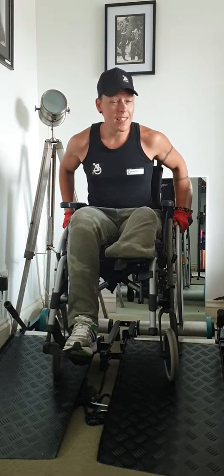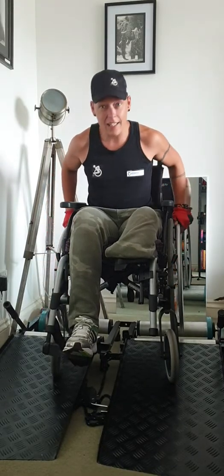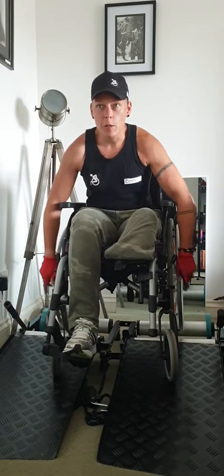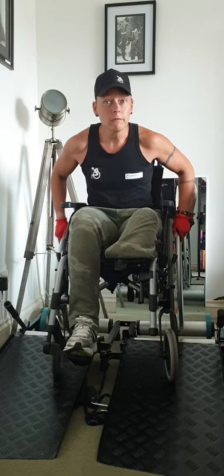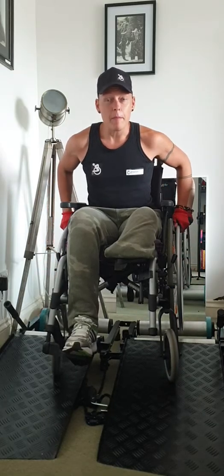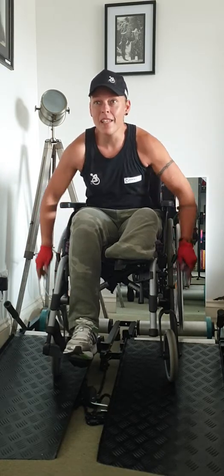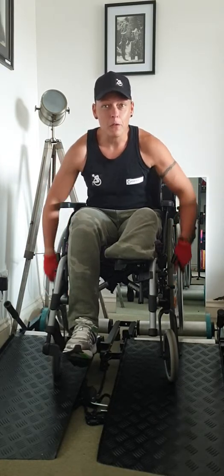I can also change the setting on this — I can make it harder and I can make it easier, which is good. I've got it at a pretty even keel at the moment, which basically feels like I'm doing a constant hill. It helps build up a bit of power and strength in my shoulders so that when the event does come I should be pretty well prepared for it.